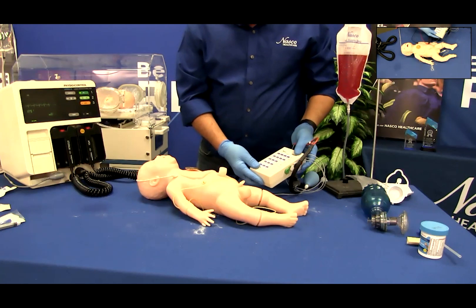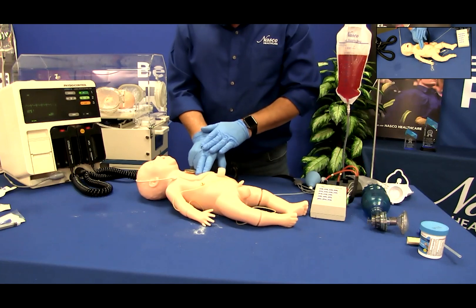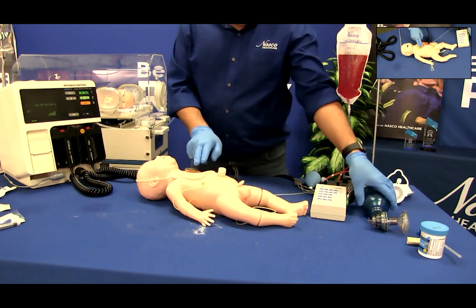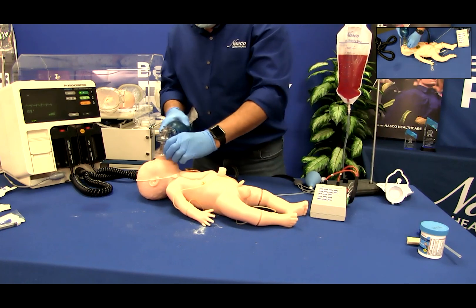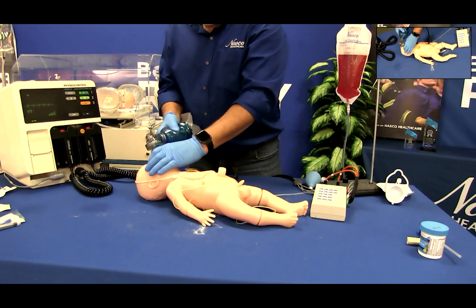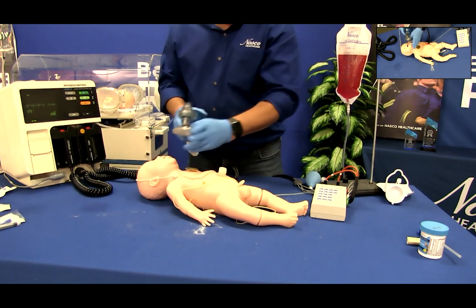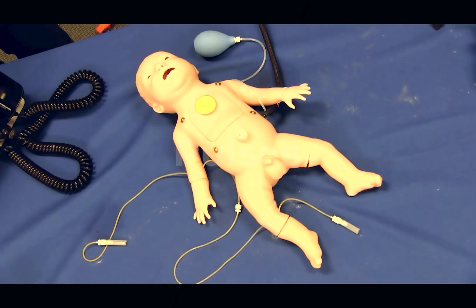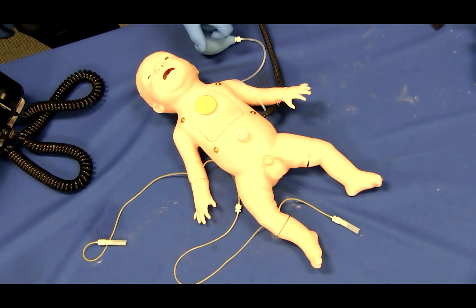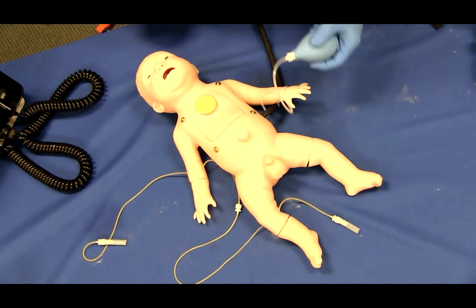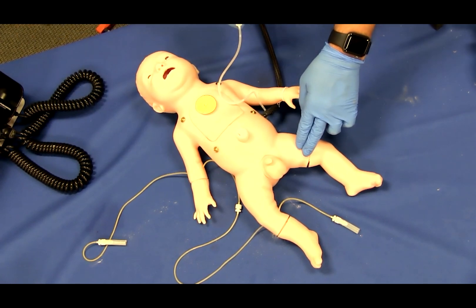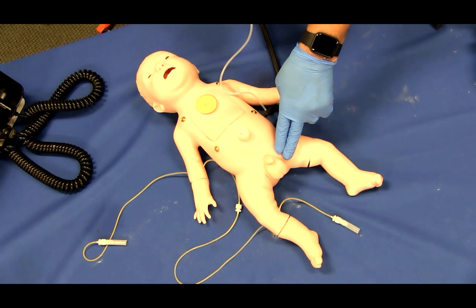CPR may also be performed on Charlie. Follow all local or national CPR standards for infants. To perform a pulse check on Charlie, gently pump the inflation bulb to activate the pulses as desired in any of the seven functioning pulse sites.